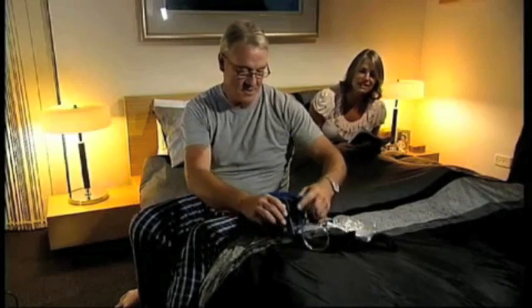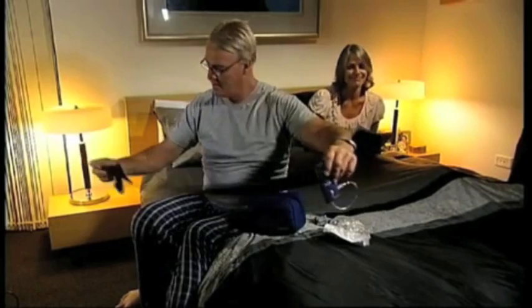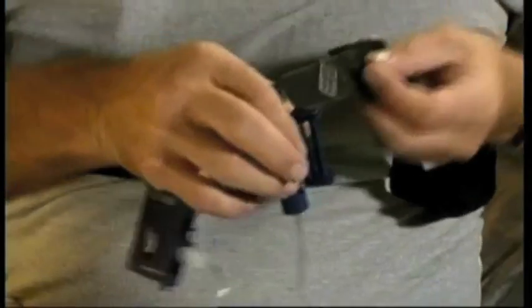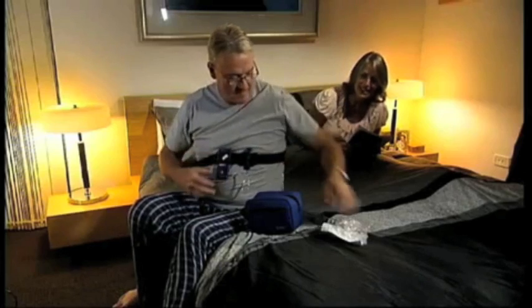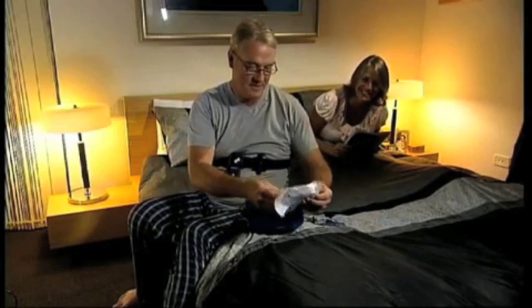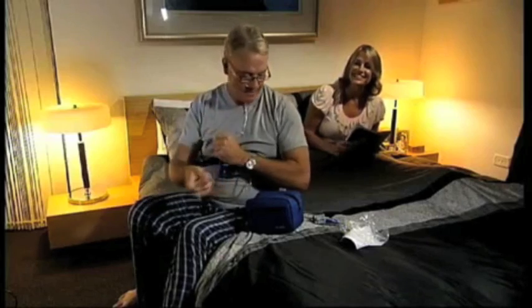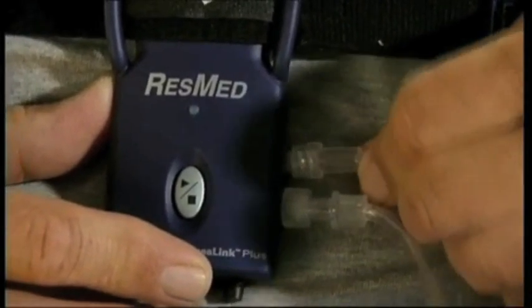The ApneaLink Plus recorder and effort sensor will, most likely, already be attached to the Velcro belt supplied. Before you go to bed for a normal night's sleep, you need to assemble and attach the other components. Locate the nasal cannula, which measures airflow with the two prongs facing downwards like this. Loop the tubing over each ear and tighten the toggle under the chin. Make it snug, but not so tight that it's uncomfortable. Insert the end of the nasal cannula into the recorder by turning it clockwise.